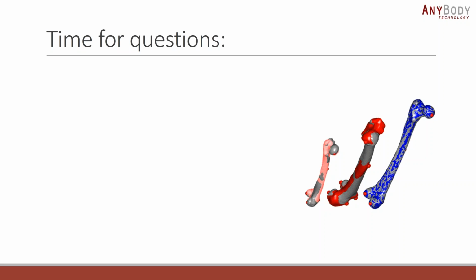Great. So probably let's just take the last couple of questions now. The next question is: have you tried scaling very thin bones? This particular user is interested in the scapula. Because the scapula is a very thin bone, are there any specific consequences that we may have to look into?